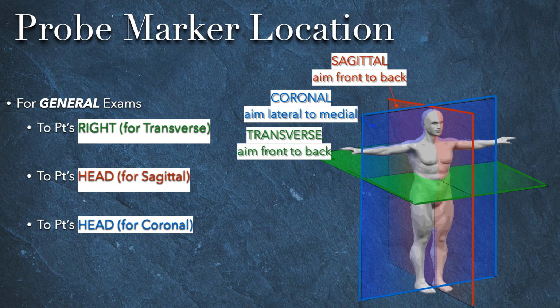comprehensive ultrasound. If you are imaging a patient in a longitudinal plane, but you're scanning from their side, this is equivalent to a coronal plane on a CT, MRI, or comprehensive ultrasound. And you'll notice that I said comprehensive ultrasound and not formal ultrasound. None of us are wearing formal wear to the ER.